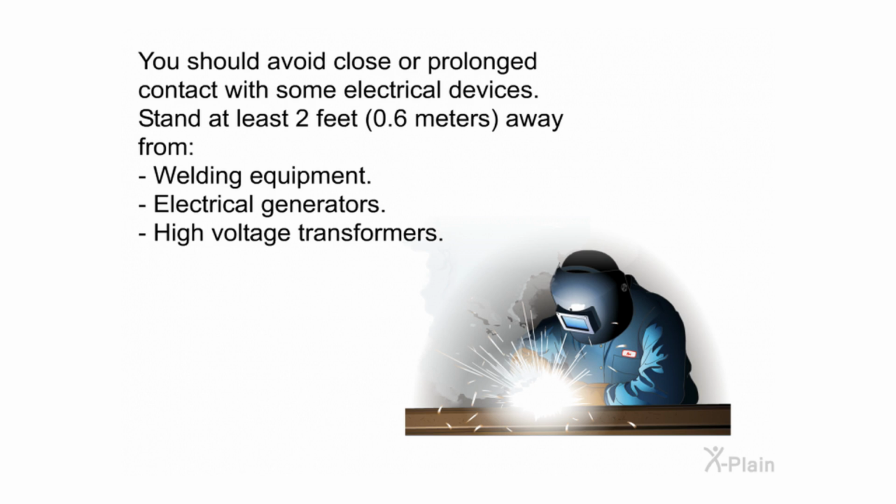You should avoid close or prolonged contact with some electrical devices. Stand at least 2 feet, 0.6 meters away from welding equipment, electrical generators, high voltage transformers.